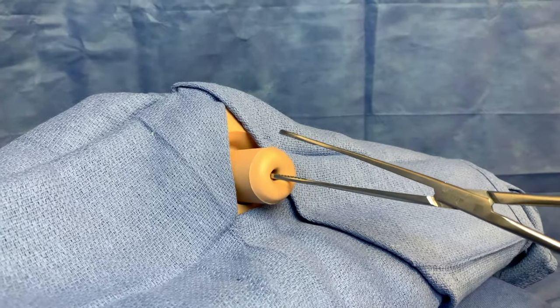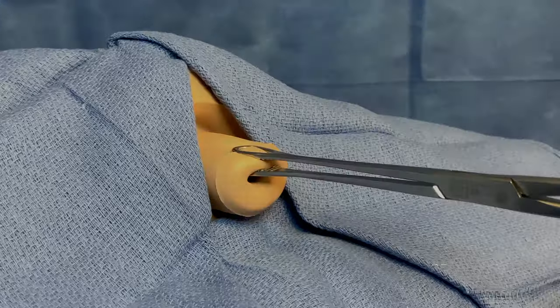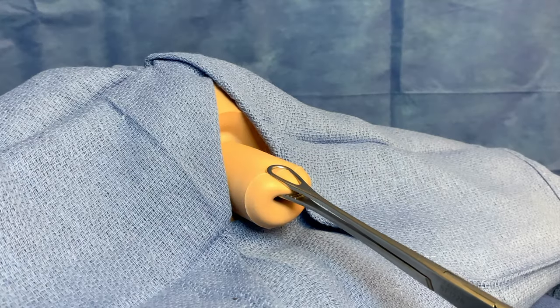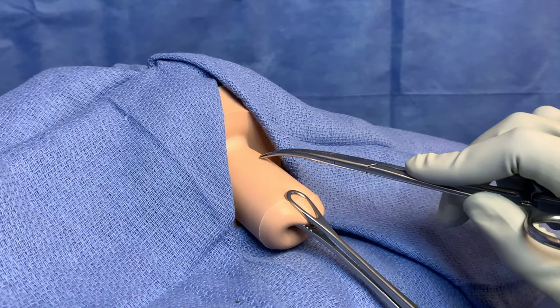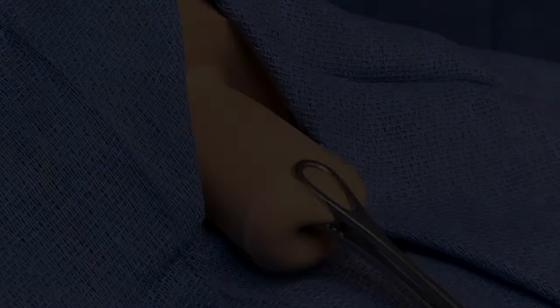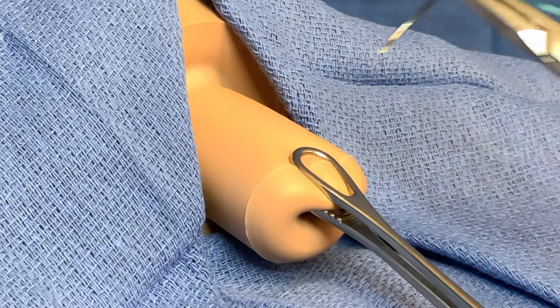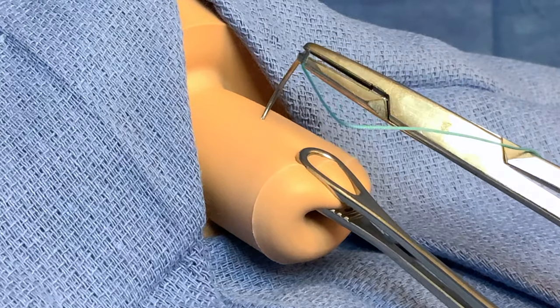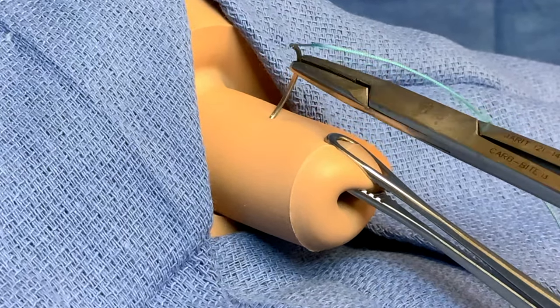The ring forcep is applied to the anterior lip of the cervix. With outward retraction, the cervical vesicle junction can be visualized. Downward traction exposes the area for the proposed suture. The needle is inserted just lateral to 12 o'clock, as high as possible on the cervix but avoiding the cervical vesicle junction.